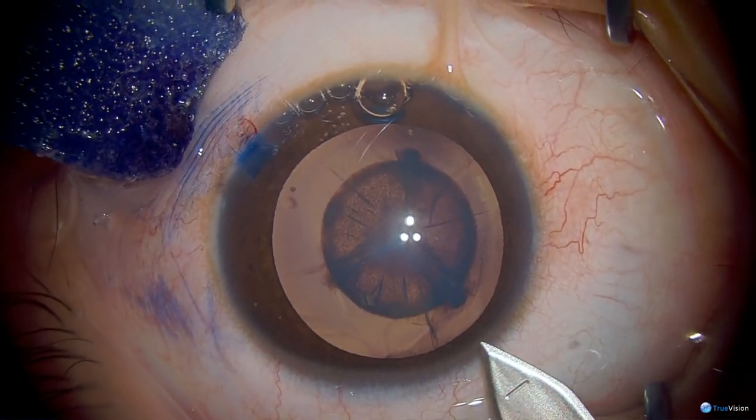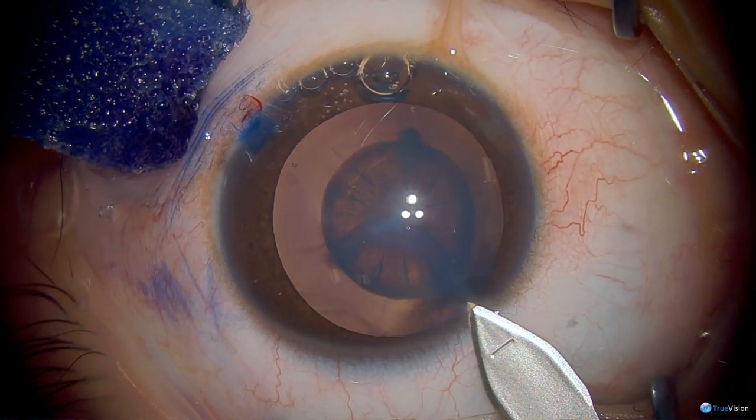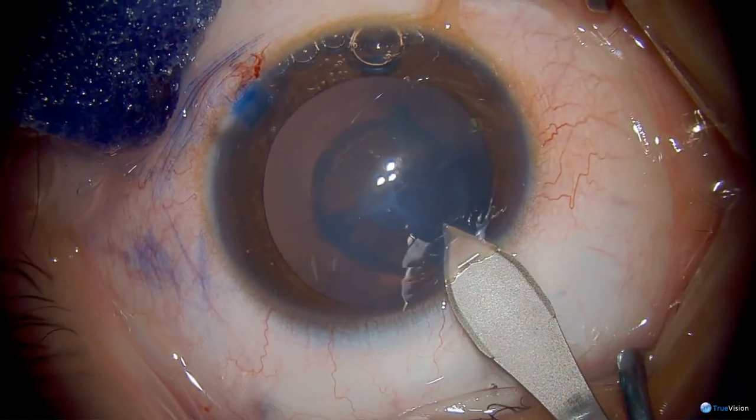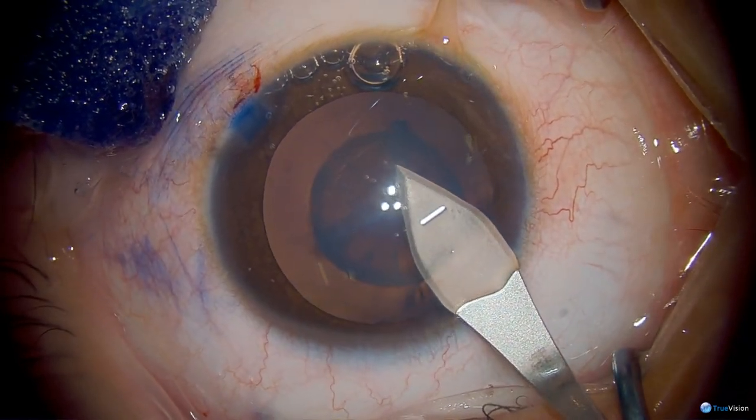Now the primary surgical wound is being created with the keratome. And you can see this being done clear corneal, just anterior to the limbal blood vessels.